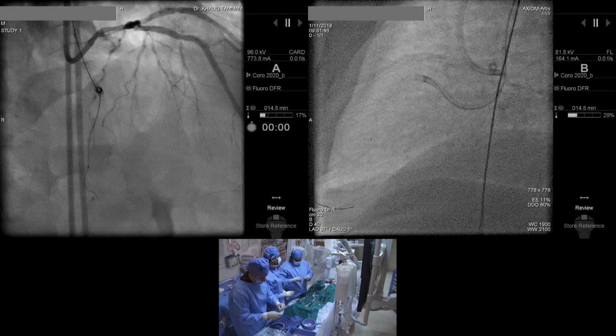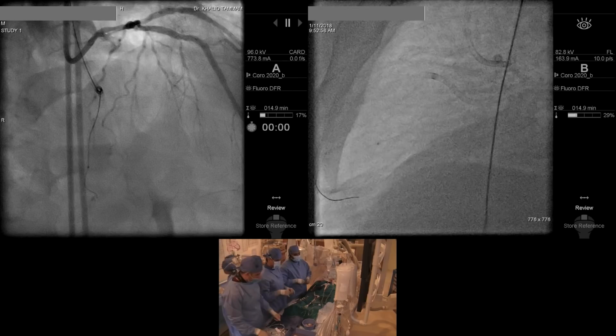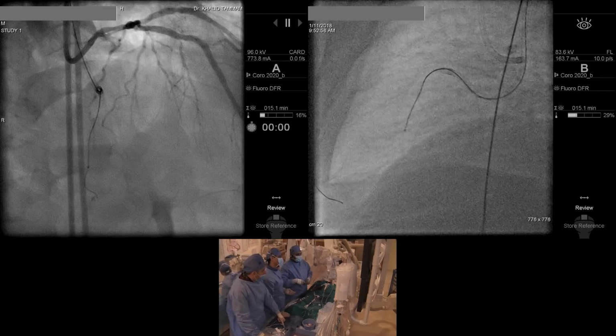One thing one should consider, when you are so far inside a longish lesion, is to dilate the proximal segment and then reduce friction for microcatheter manipulation. But if we do that, we burn the possibility of doing antegrade injection for testing. Yeah, but you are beyond the antegrade filling now, I think. Is this a Gaia 1 or 2? 2.